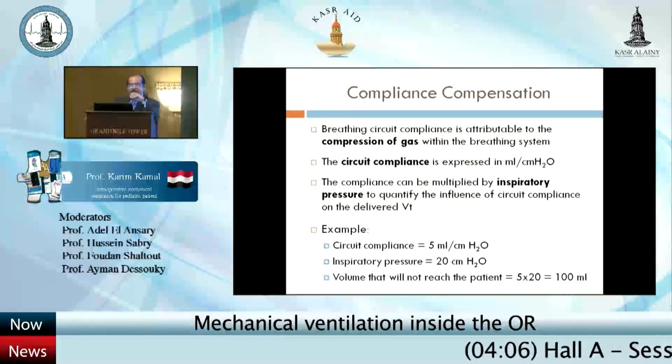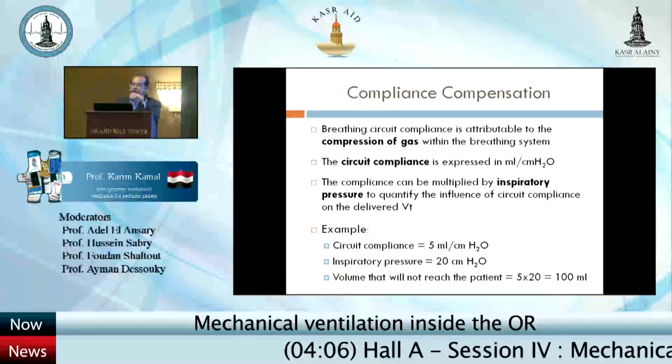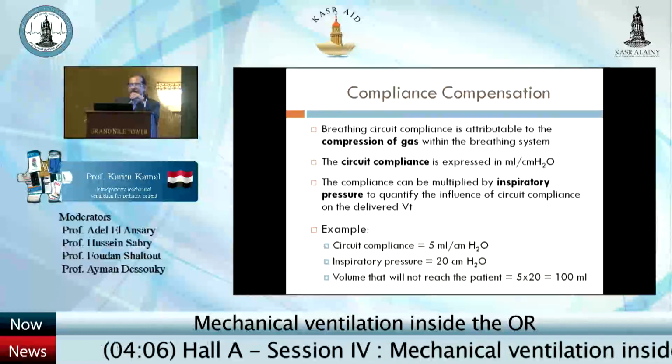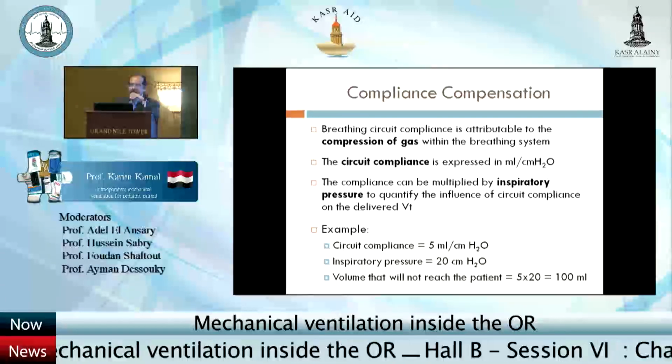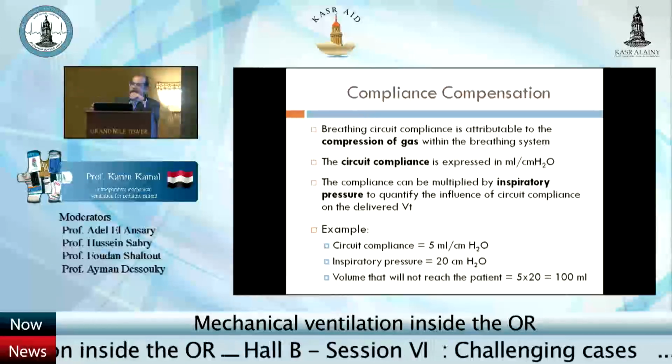The circuit compliance is expressed in milliliter per centimeter water, and the compliance can be multiplied by the inspiratory pressure to quantify the influence of circuit compliance on the delivered tidal volume.